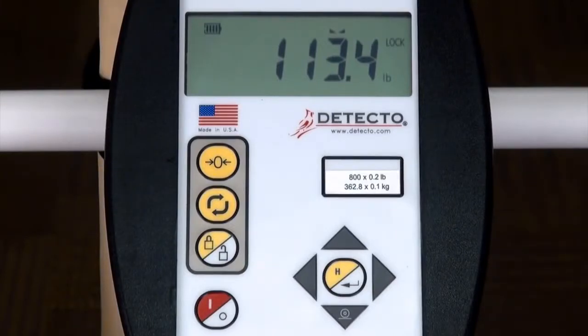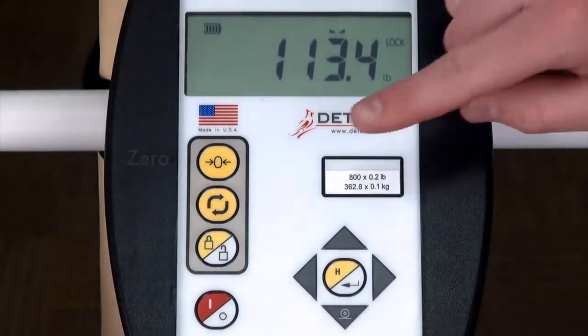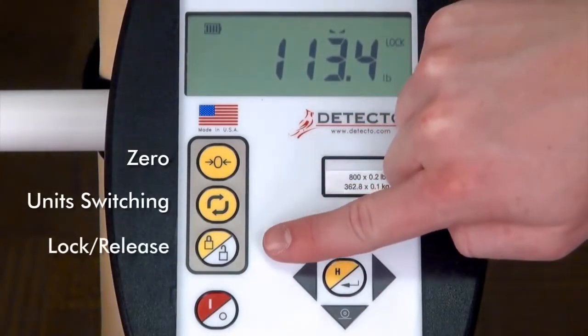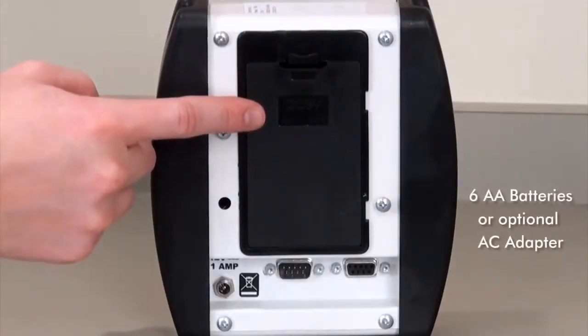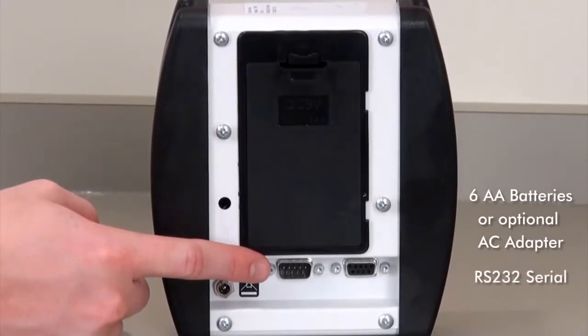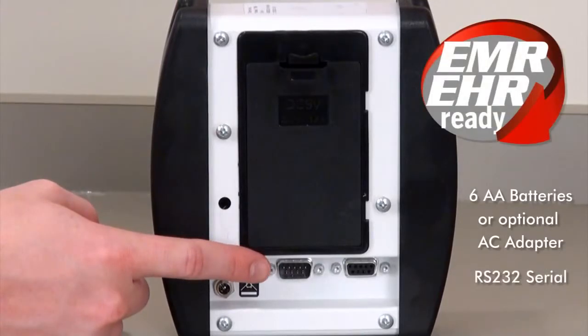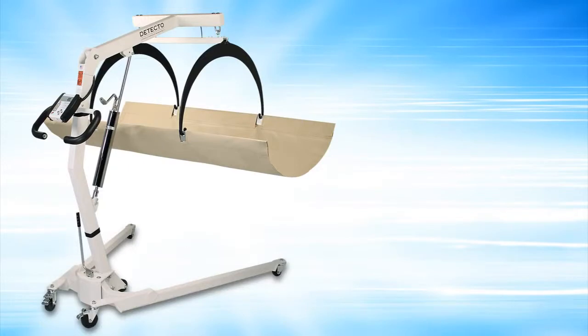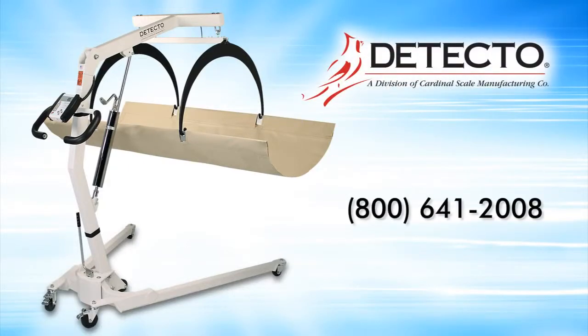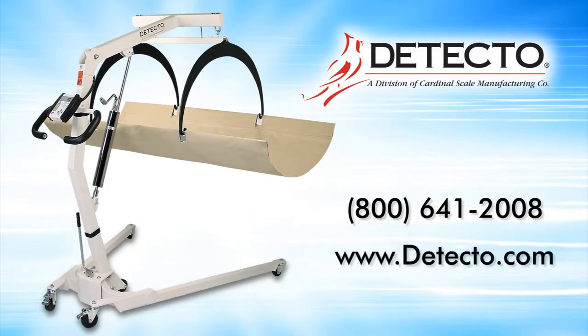Detecto in-bed scales utilize the USA-made 750 indicator that is very simple to operate, with keys for zero, unit switching, and lock release. It's powered by six AA batteries or an optional AC adapter, and is equipped with a serial interface port, so it is EMR/EHR ready. To find out more about this and other Detecto clinical scales, please call us at 1-800-641-2008 or visit us online at www.detecto.com.